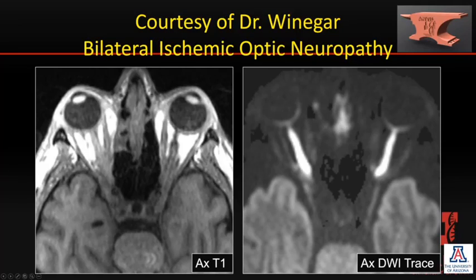So here we have a case from Dr. Winegar of bilateral posterior ischemic optic neuropathy.